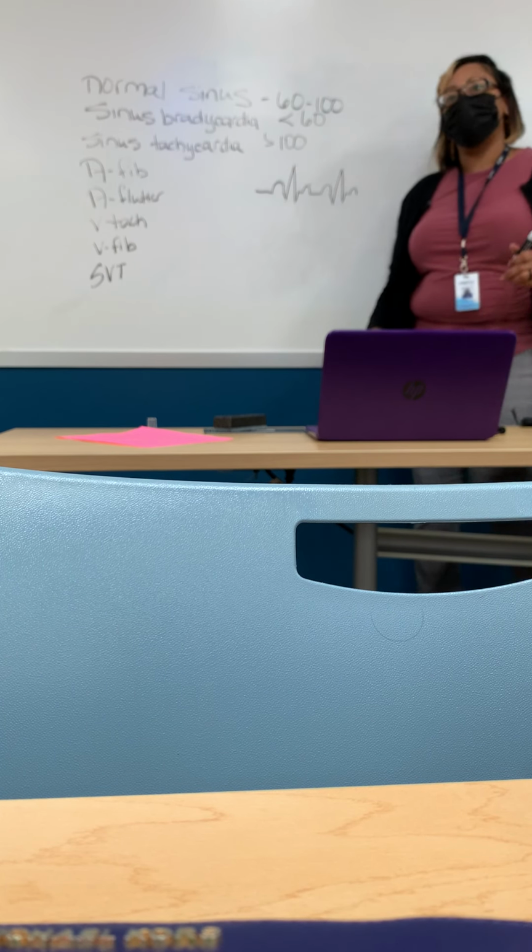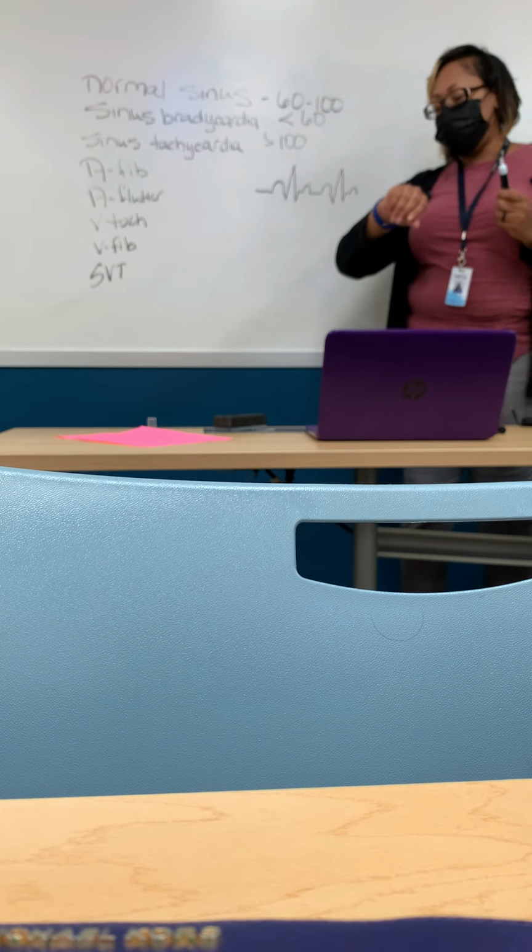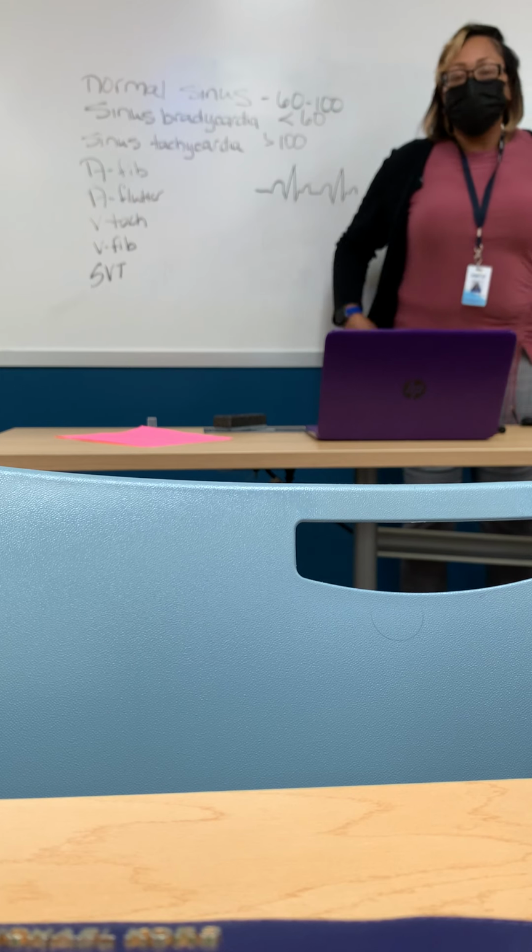So number 11. Look at slide number 11. Where would we find it? In our weekly announcements. It says week 8, dysrhythmia. Those are 6-second strips. All of your strips will be 6 seconds. You'll get an EKG class, that's a capstone. We're just hitting these hot topics. You'll be able to pinpoint these just by looking at them before you leave here, I promise.